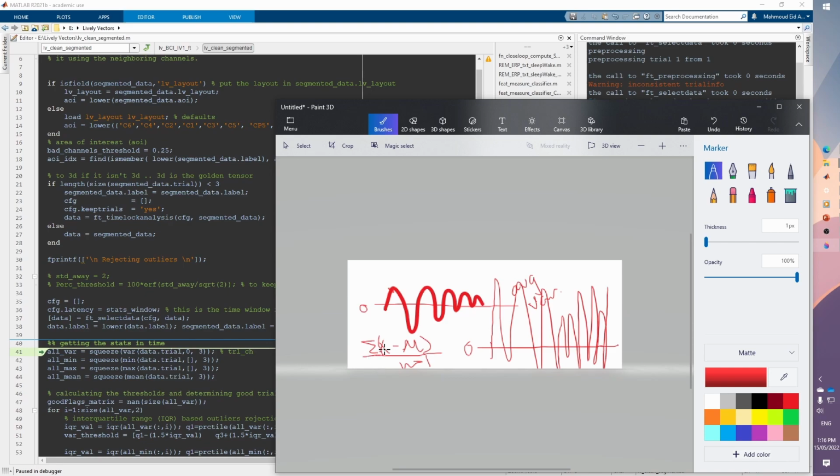So it's more or less something like this. We take every sample, we subtract the mean from that sample, we repeat this for all samples, and we square this before we sum. So we take the difference, we square it, and then we sum this for all samples, and then we divide by n minus 1, where n is the number of samples. So if we have 100 samples here, this will be our n, so we'll be dividing by 99. Okay, so that's a basic idea about the variance.